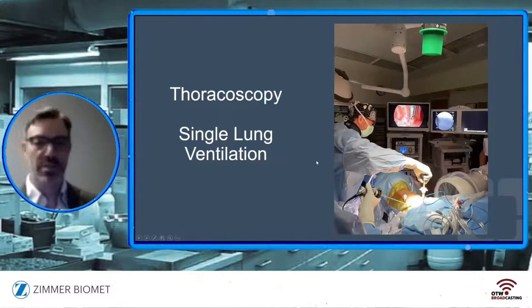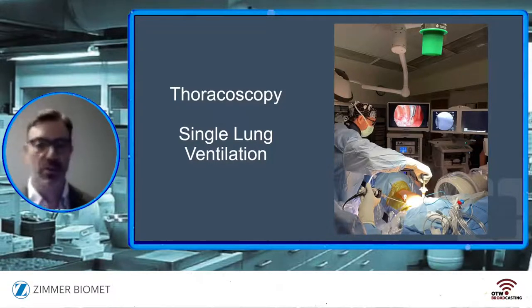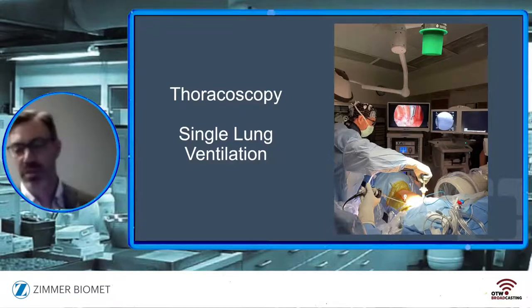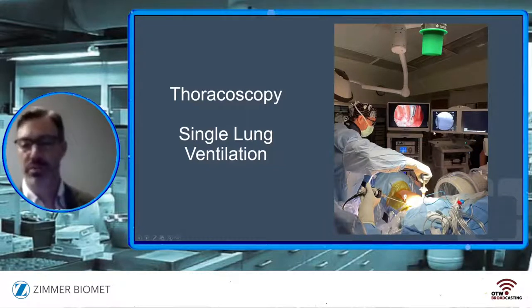And as I mentioned, it's a thoracoscopic procedure. So the patients have to tolerate single lung ventilation and the anesthesia team has to deliver this for us. Some surgeons will use an access surgeon for the thoracoscopy portion. Other orthopedic surgeons prefer to do their own thoracoscopy, which is my preference because I was fortunate to have training in this area. And again, patients are on single lung, and you can see here this setup with the C-arm across the table with the monitors next to each other for the thoracoscope as well as the C-arm.